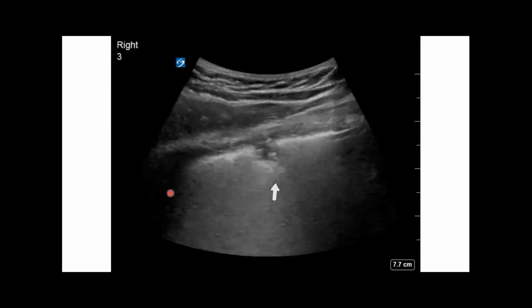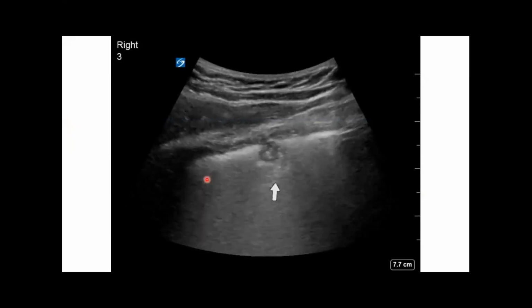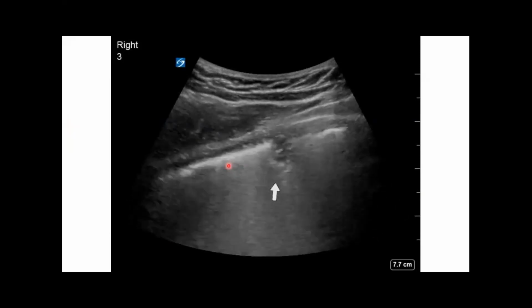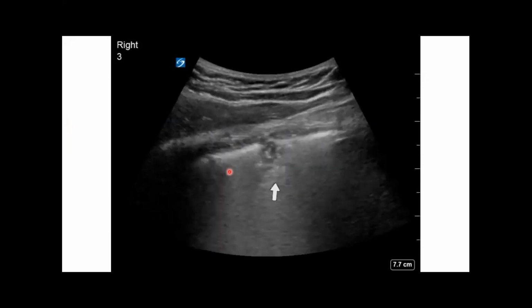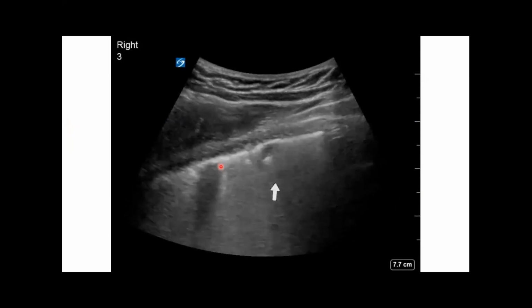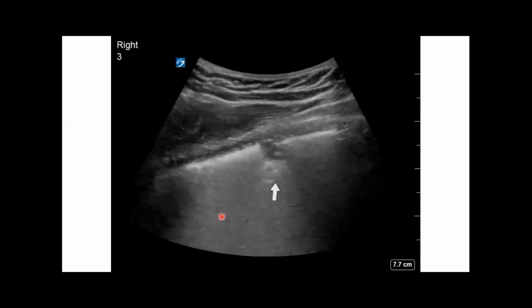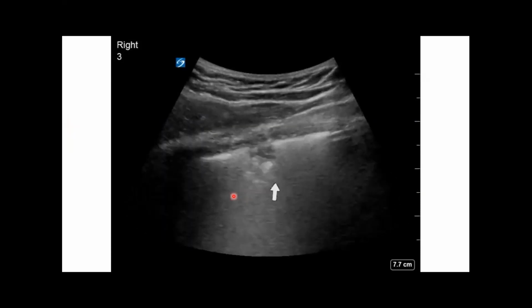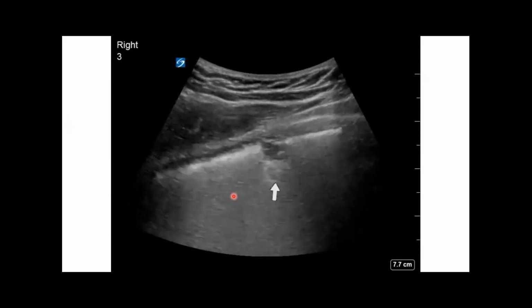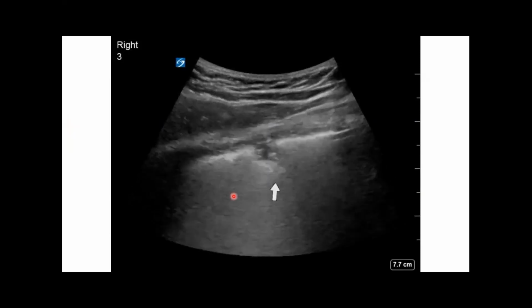And again, just decreasing your depth increases your resolution. And you're also seeing some skip lesions here that Dr. Shrikant mentioned. He's breathing so fast, but if you focus your attention to the pleural line, right through this area, see it intermittently has these normal aerated lungs between these B lines. So that is another finding that's concerning for COVID. And what that actually is, fixed B lines.